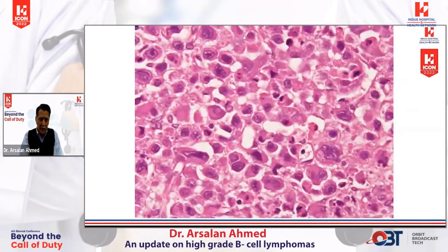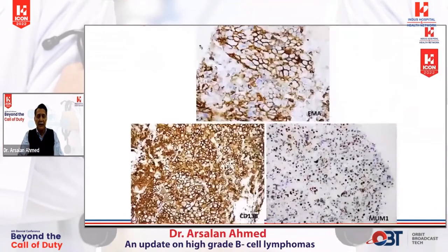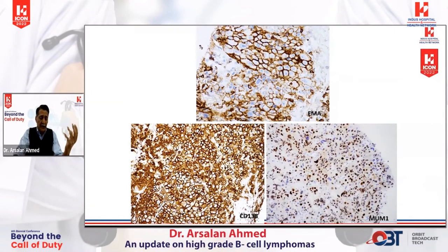The thing which caught my mind was they had a plasmacytoid look, a lot of eccentric-looking cytoplasm, but very aggressive, with very prominent nucleoli. This is a very important point for this tumor: these beautiful prominent nucleoli. These cases were LCA negative, CD3 negative, CD20 negative, CD30 negative. The tumor came out EMA positive, CD138 positive, MUM1 positive. So it had a plasmablastic morphology retrospectively, and immunohistochemistry also supported plasmacytoid origin. Whenever you have such an ugly tumor with prominent nucleoli, plasmacytoid looking, although B-cell markers are completely negative, and MUM1 and CD138 are positive, CD30 is negative, and it is very aggressive.